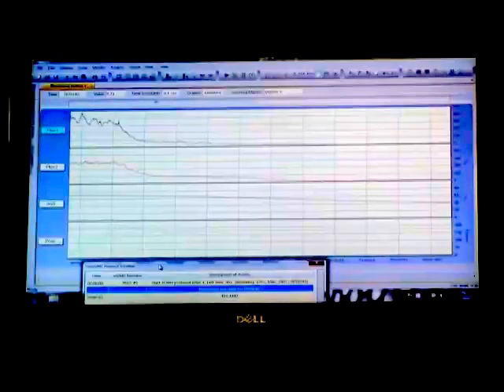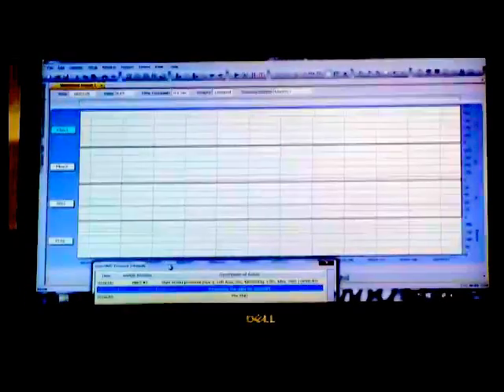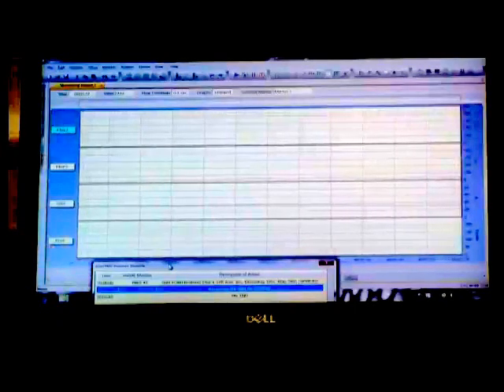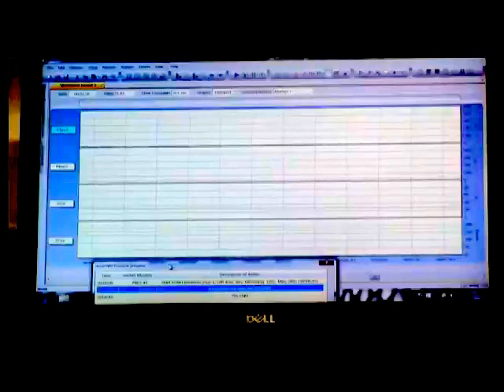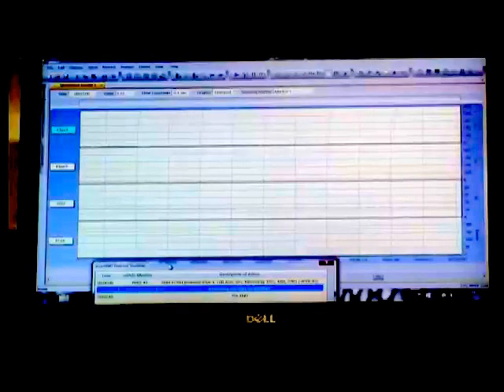The tissue oxygenation reading is also affected due to the inflation of the pressure cuff. After this 2-minute hold period, the pressure cuff will deflate and you'll see the return of the blood flow. During each part of the protocol, automatic markers are put in to aid automatic analysis of the data.